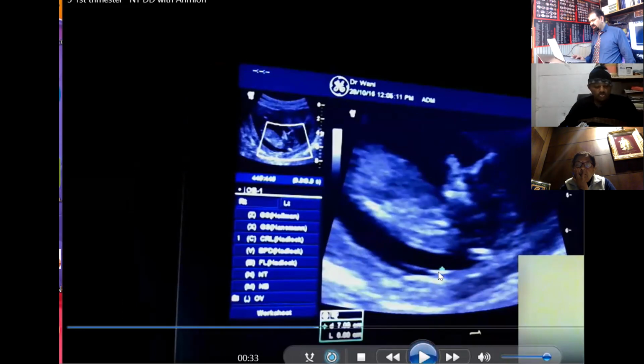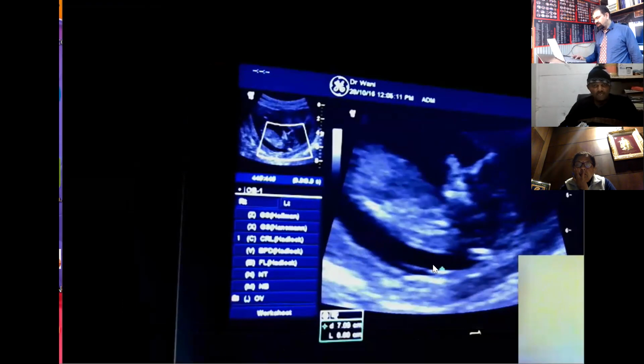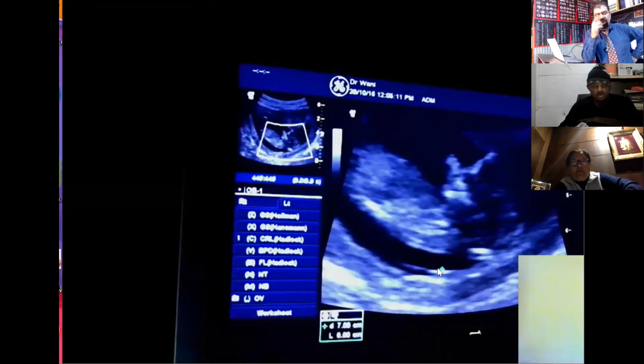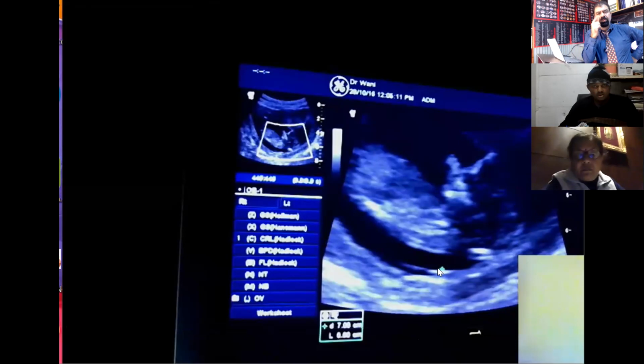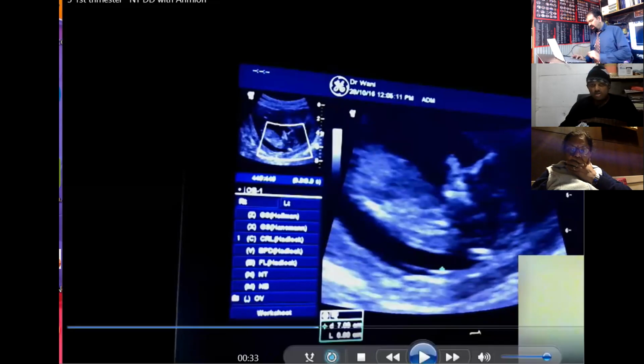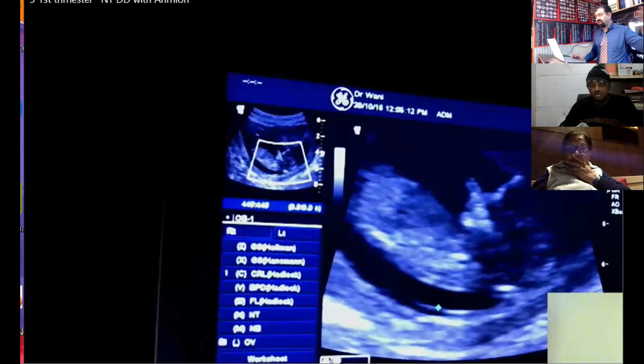And now see over here, this is the area which can be mistaken for the nuchal translucency. And if you label this as nuchal translucency, you are committing a blunder. Why? Because you are not keeping the amnion in your mind. You may be cheated by an amnion, and it will look like you are dealing with a thick NT, I mean an increased NT. So make sure that you are not hitting the amnion.